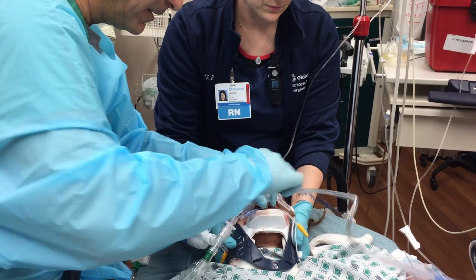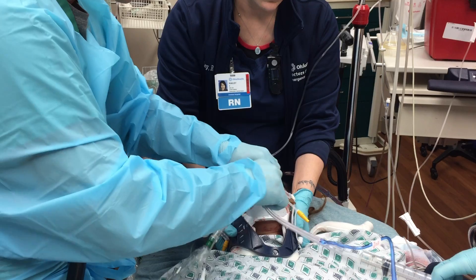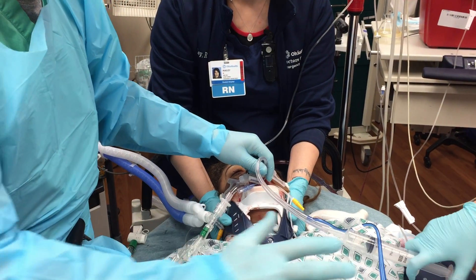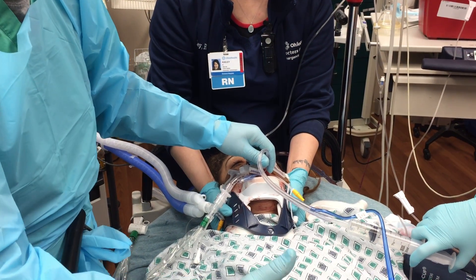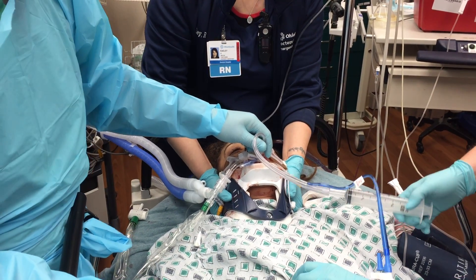Then I'm going to take the NG tube with a little more Surgilube and put it in. This is a rapid, effective way to decompress the stomach in any emergent situation, especially in a post-arrest when the abdomen is distended. It decreases the distension and improves venous return to the heart.